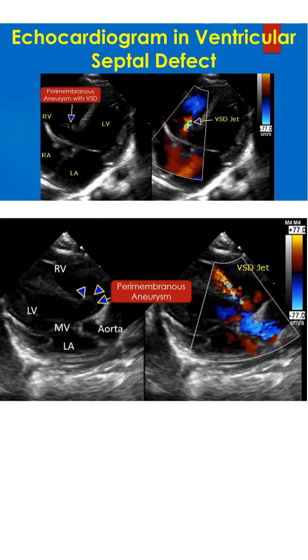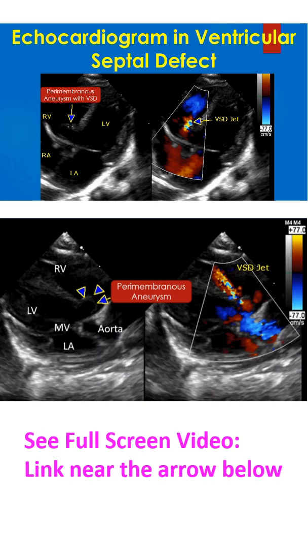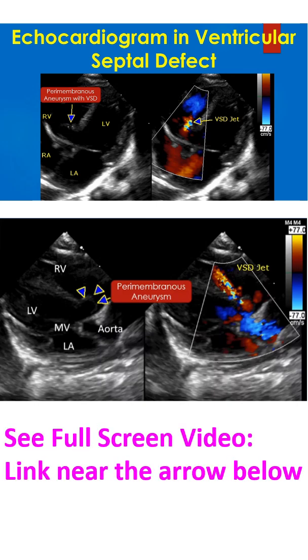Echocardiogram in a tilted apical 4-chamber view showing all 4 cardiac chambers: RA – right atrium, RV – right ventricle, LA – left atrium, LV – left ventricle. The perimembranous ventricular septal aneurysm with defect is marked by an arrow in the left panel.